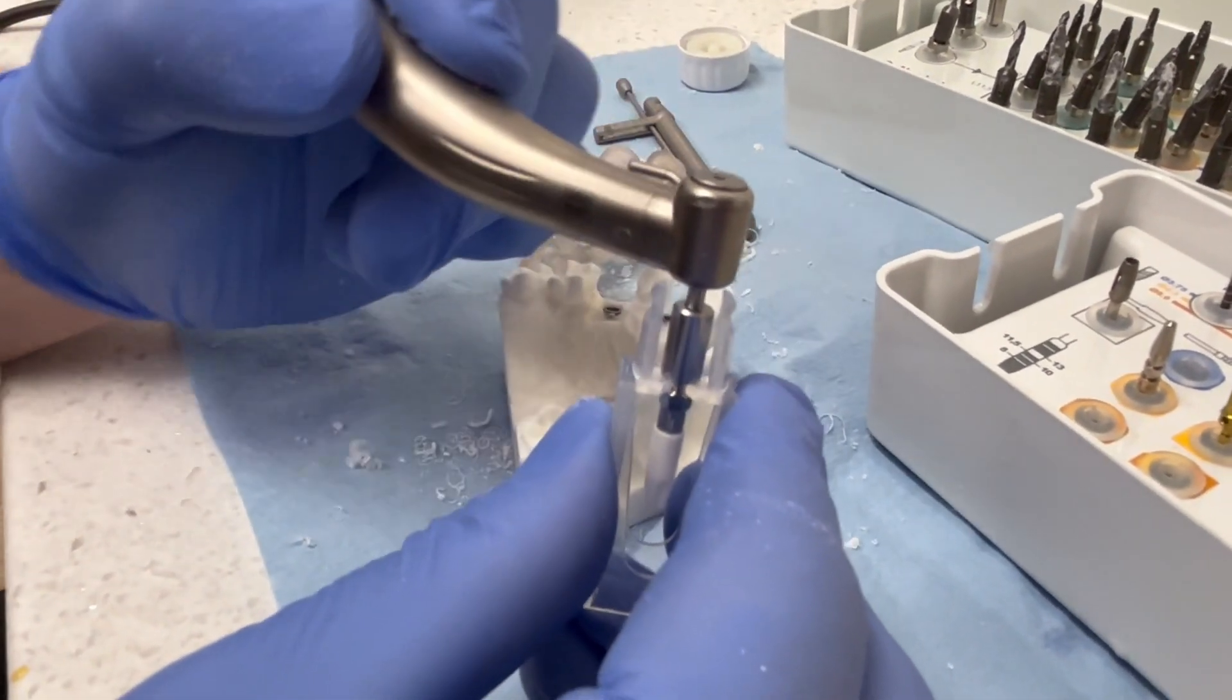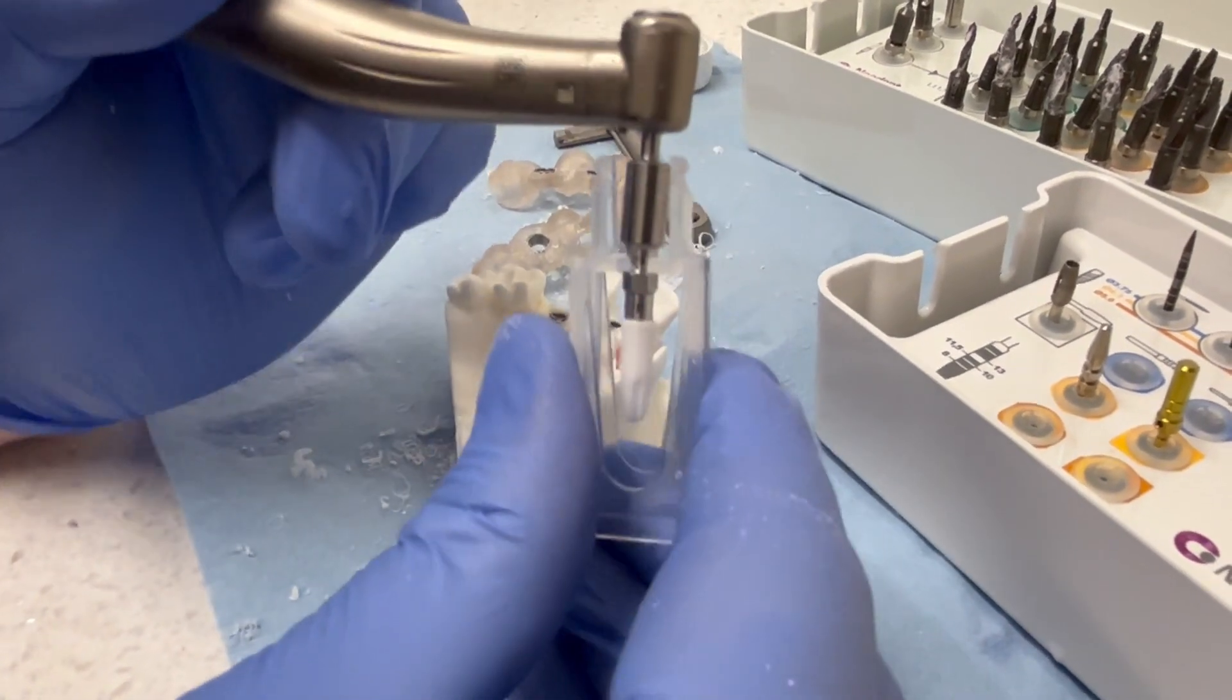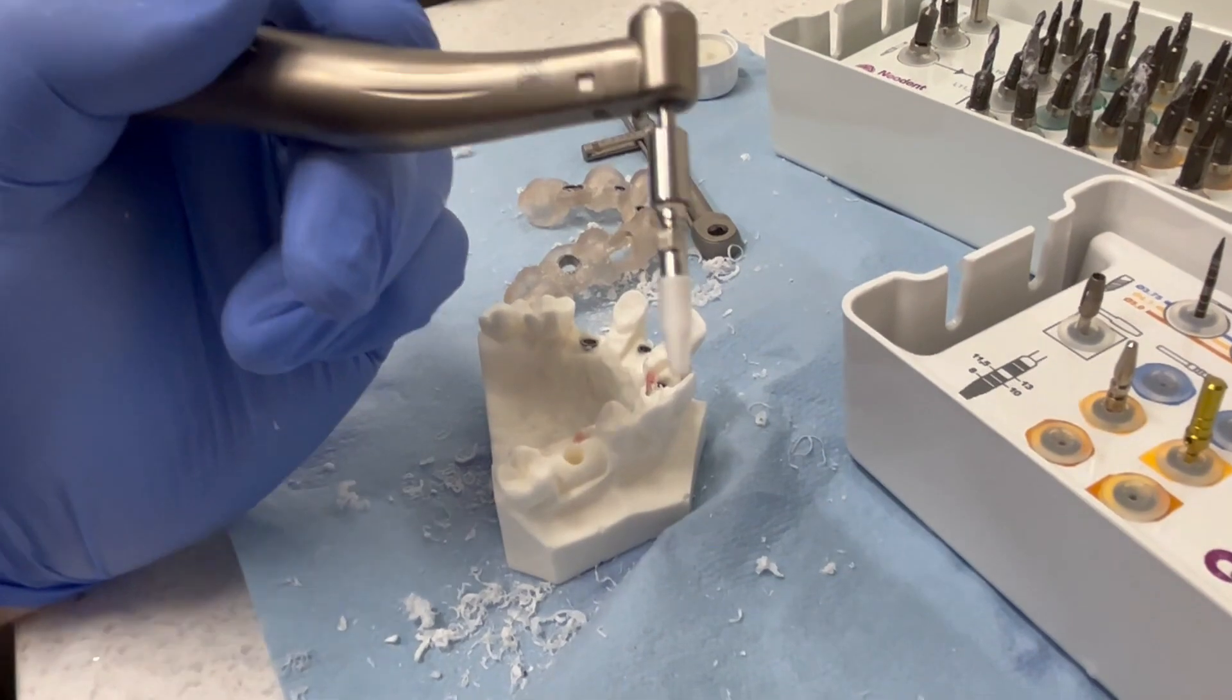We're going to go down until we see this fully engage onto the mount. So you can see now I can hold this. And I'm just going to pull this straight out the directions the arrow tell us. And you can see how sturdy this is.